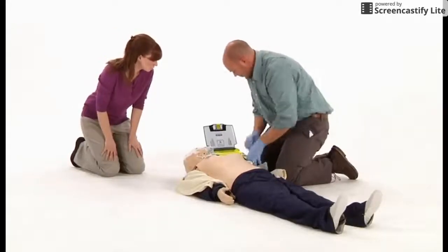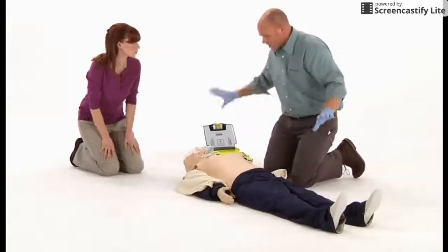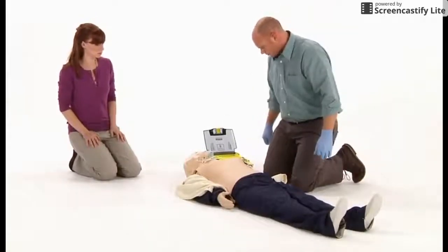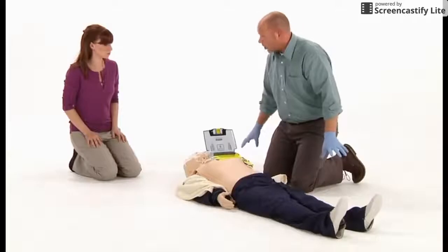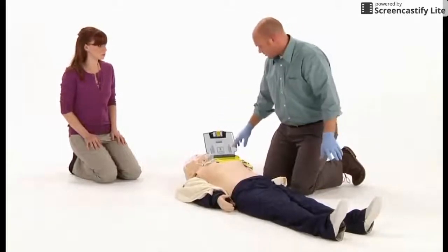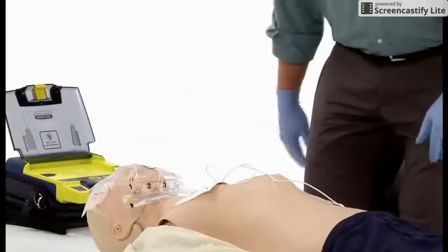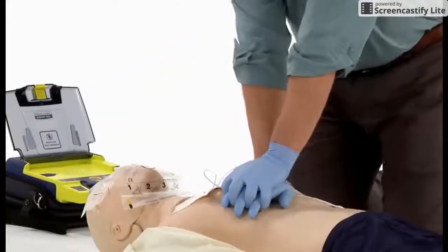Analyzing heart rhythm. Do not touch patient. Do not allow yourself or anyone else to touch the person while the AED is analyzing. During shock, move away from the patient. Make sure that no one, including you, is touching the person. Press red flashing button to deliver shock. Shock delivered. It is now safe to touch the patient.